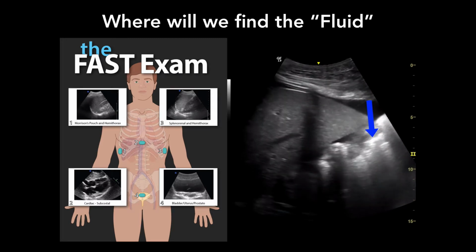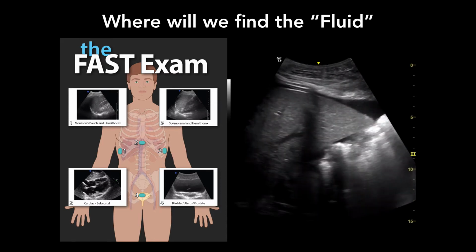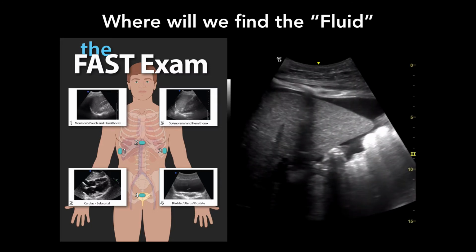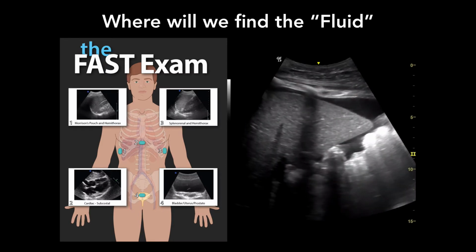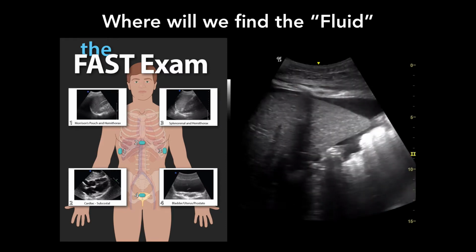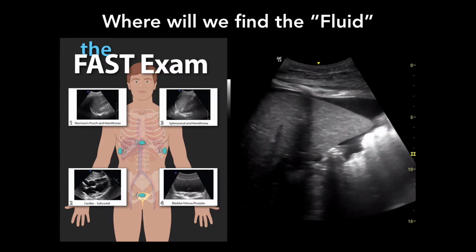What's this bright stuff? What's all this bright stuff? Bowel. Excellent. So how did you know that was bowel? So what's bright on ultrasound? Fluid is dark or black, anechoic, and what's bright is bone and the other enemy of ultrasound. Air. So why do you have air in your belly? It's in your bowel, right? So that's bowel. Bowel looks bright because it's full of air.